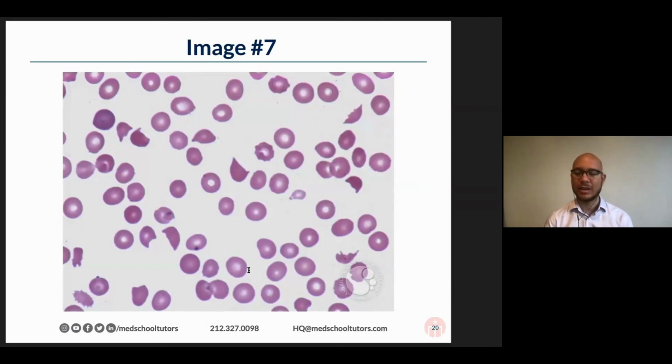And here again, the cell type that we're focusing on are the red blood cells. There's some pretty normal looking red blood cells in this image, but these cells in the top left corner, they're really all over the place. Folks are correctly pointing out helmet cells, schistocytes. Schistocytes is the finding here. I'll show an example of sickle cells a little bit later. They look a little different, a little bit thinner. So we can compare and contrast that a little bit later.